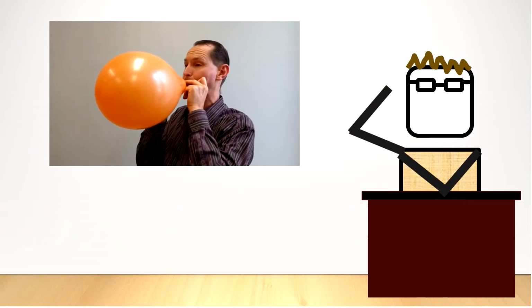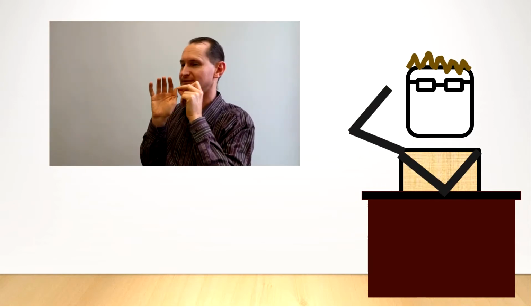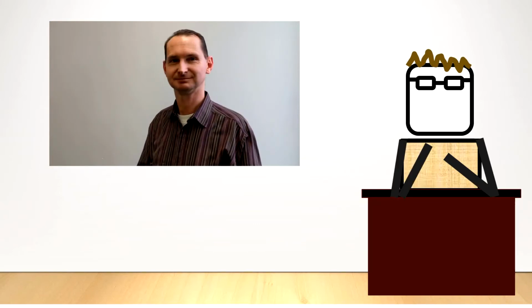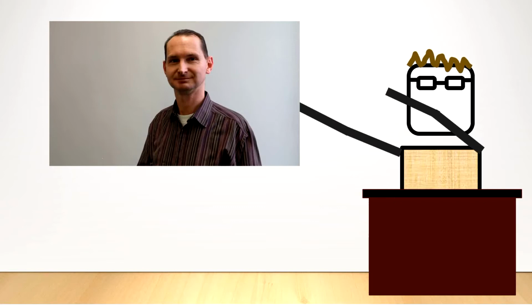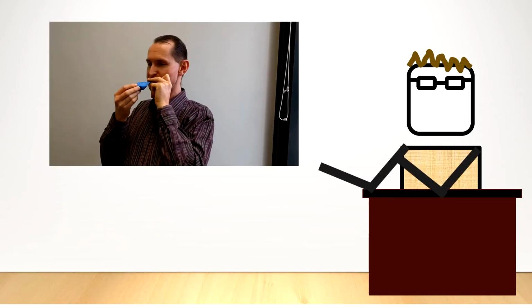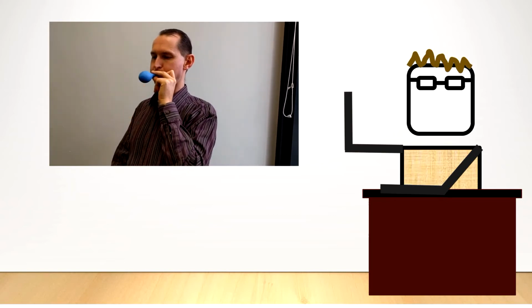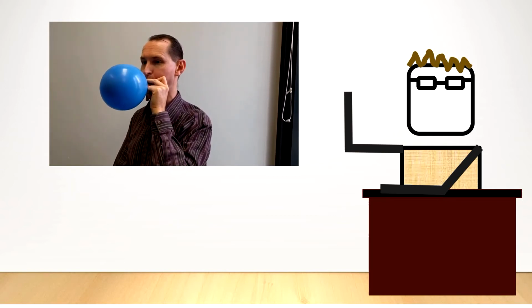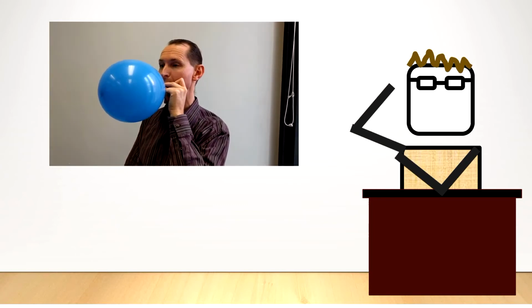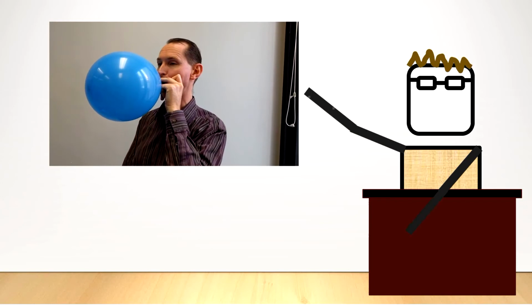However, once the balloon is almost completely filled, it really can't increase its volume anymore without putting in an awful lot of extra pressure in order to try to get that volume in, until you reach a critical threshold where the balloon pops. Now compare this to a balloon that has already been blown up before, and you'll notice that the compliance of the balloon is a lot higher, and it takes a lot less pressure in order to blow up the balloon to the same volume.